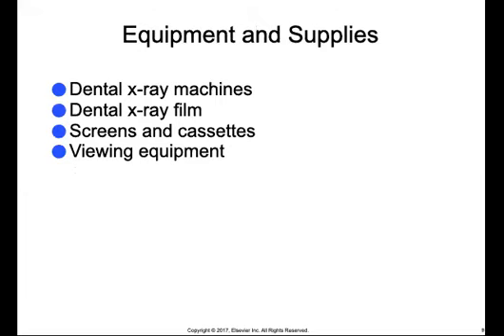Quality control tests are necessary to monitor all the dental X-ray machines, film, screens and cassettes, and viewing equipment. Everything must be in good working order to produce diagnostic radiographs. This includes the dental x-ray machines, the film, the screens and cassette, as well as the viewing equipment.